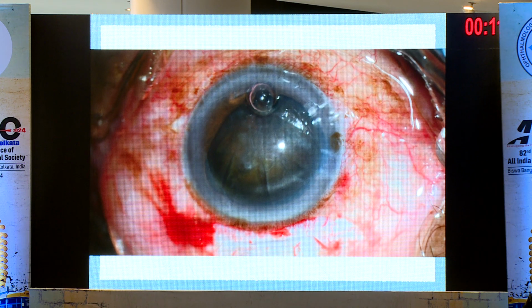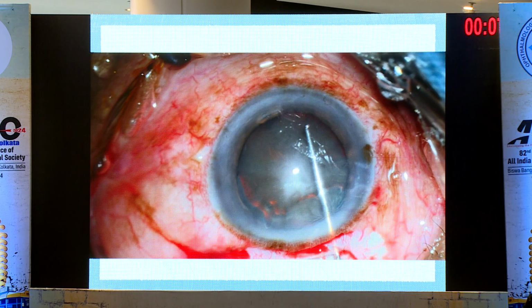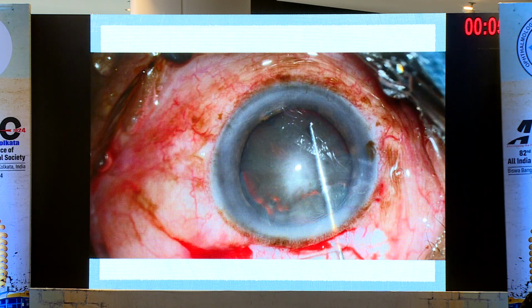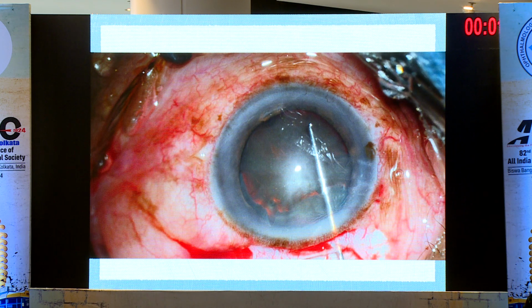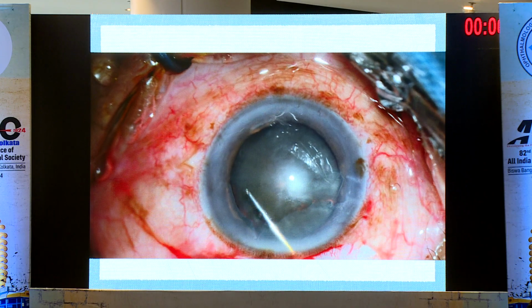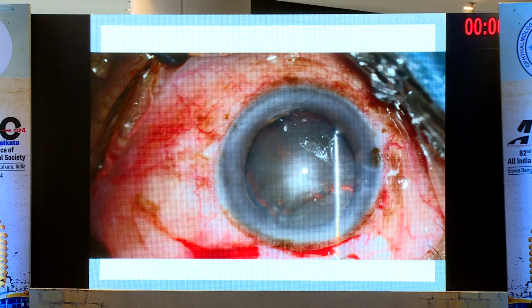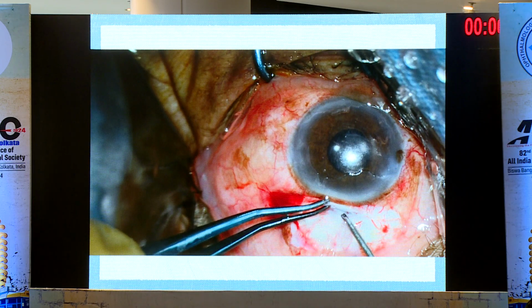You can see that I've done a large rhexis, prolapsed the superior pole of the nucleus out, and then basically, in this particular instance I took off the DM first, but you could also do it after your intraocular lens is implanted. So this video should have come earlier, and then the nucleus removal.